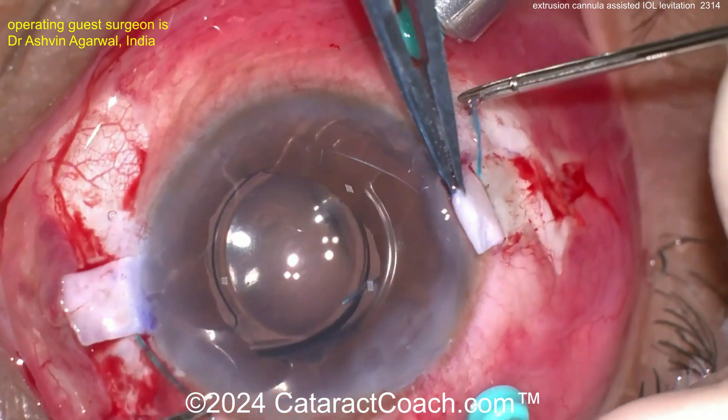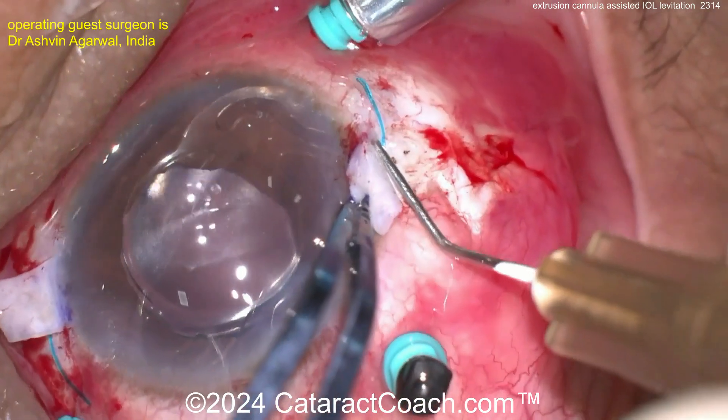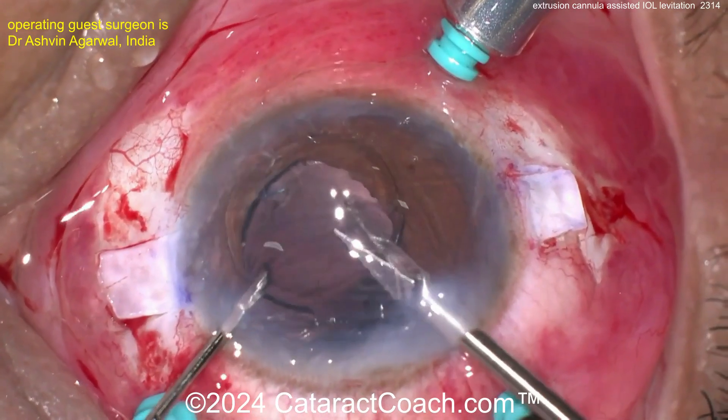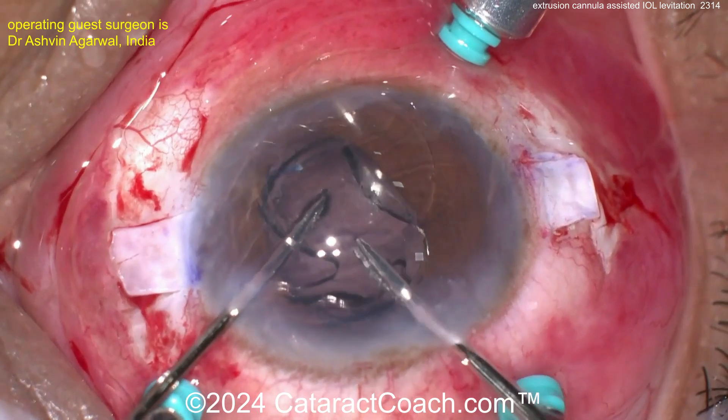Externalizing the second haptic. The nice part of this technique is you have nice long tunnels. You can see the Schariath tunnel being created with the needle, and the haptic is going to go inside that tunnel. This gives very broad and strong fixation — the lens won't go anywhere.